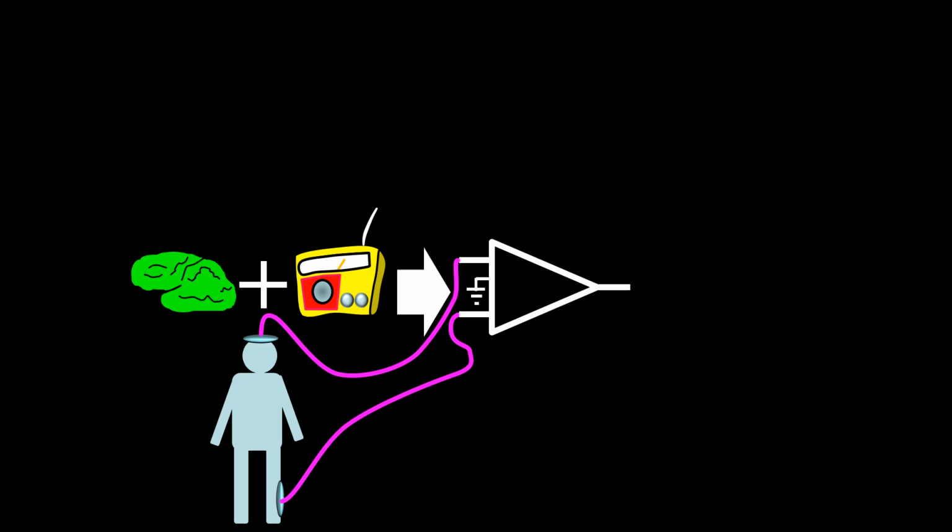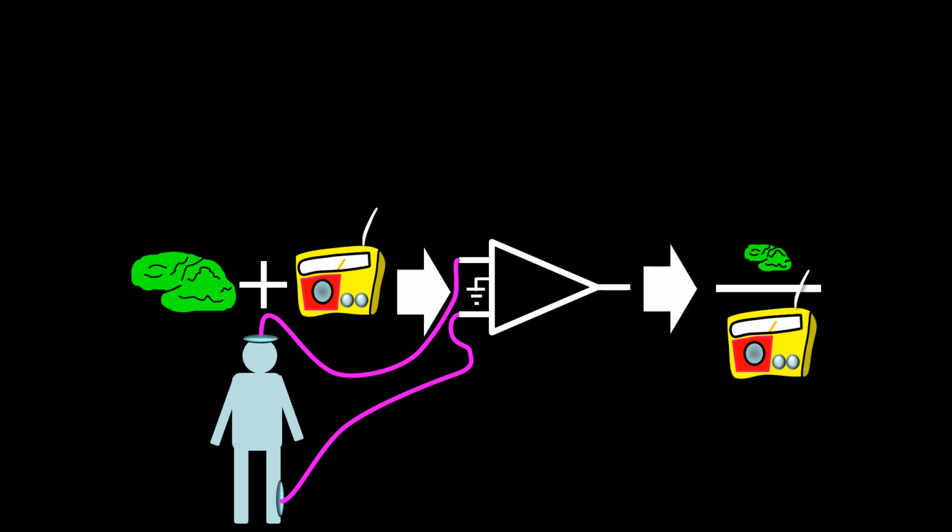I assume that the early electroencephalographers' reason for choosing the leg was that the cerebral activity in the head and in the leg was obviously different, and noise would be, or so they thought, about the same at both places. But it was not to be so. The noise was too much. They concluded that the EEG epoch collected with the second input attached to one leg was unreadable.